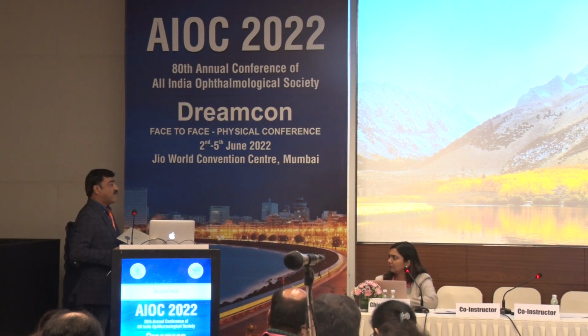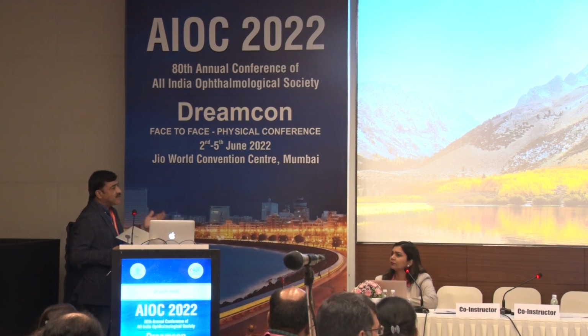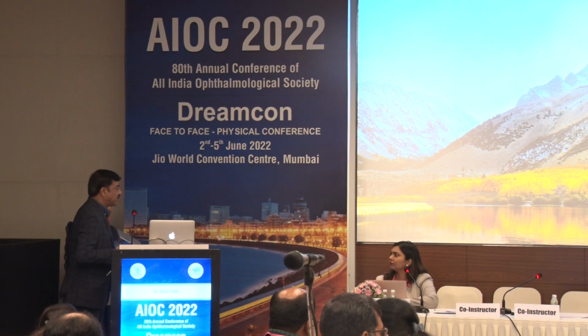I never tell the patient that I am doing an astigmatic correction for you. This is something I would not have done otherwise, but even for the multifocals, I'm using a particular brand which still does not have a toric trifocal, and the other ones do have. For them, even for 0.5, I'm putting an arcuate incision.